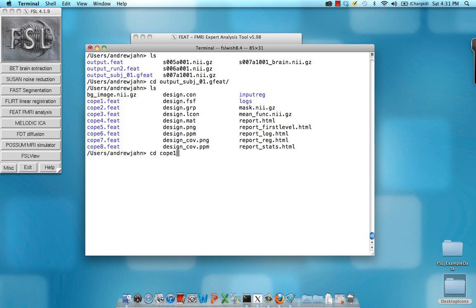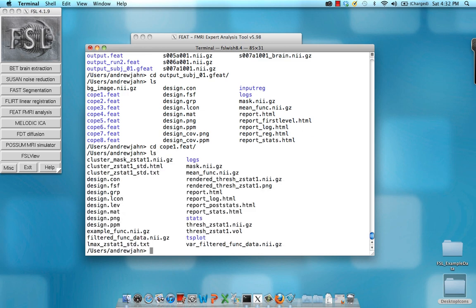So I'm going to go into, say, cope one dot feet, which again is a contrast of left minus right. Within there, as we saw before with analyzing each individual run, you see what pops up within the HTML files tracking your progress, such as logs, any log information, time series plots, and what's probably of most importance to you is stats.